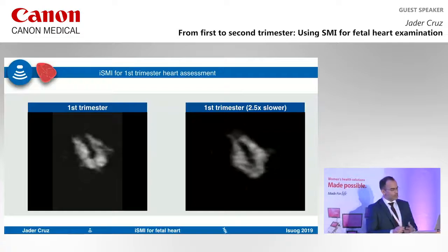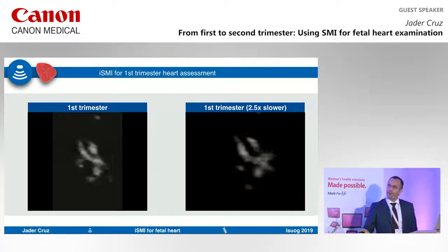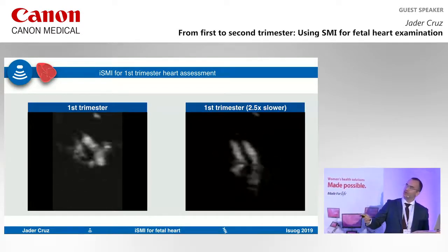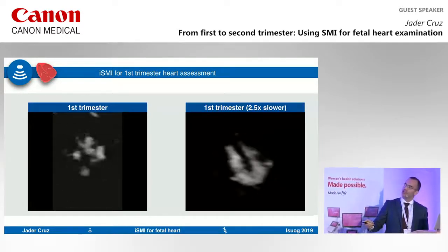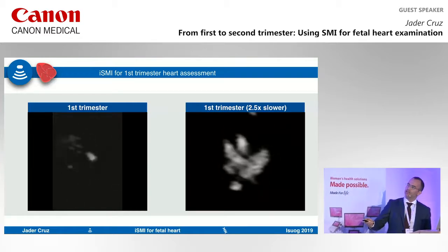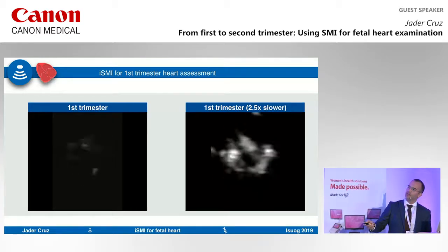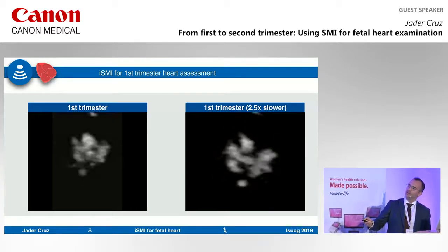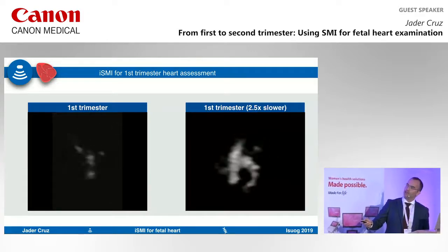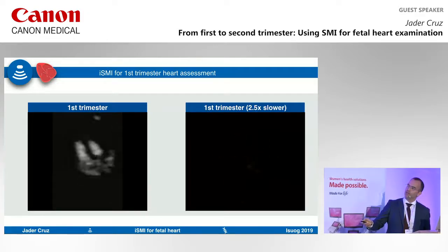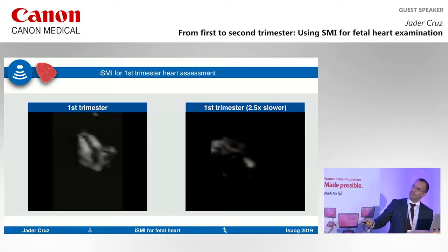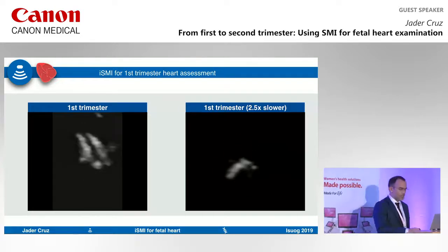Here is a first trimester sweep of the heart shown at a slower pace so you can see the details better. You can very clearly see the interventricular septum and the aorta. The pulmonary artery is coming with the branching visible, and then the three-vessel view where you can actually see the superior vena cava.